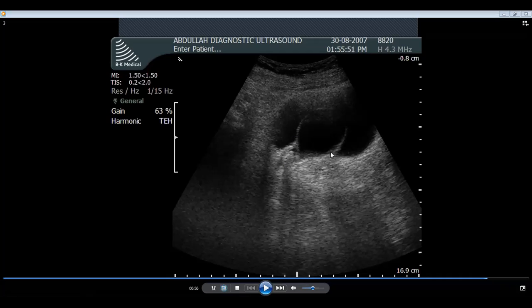And this is the herniating distal end of the ureter into the bladder. This is called ureteric hernia or ureterocele. Ureterocele. Usually, it leads to recurrent urinary tract infection and stone formation.